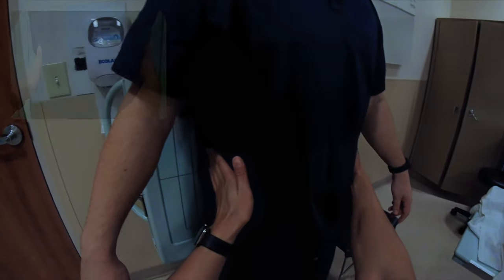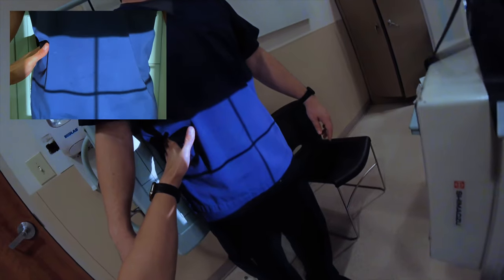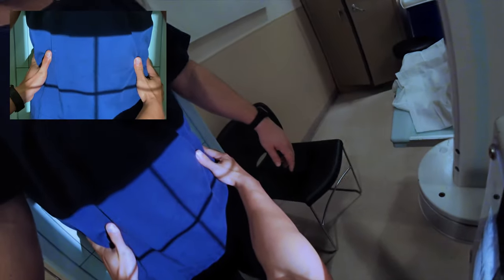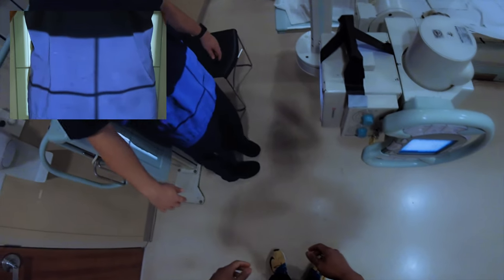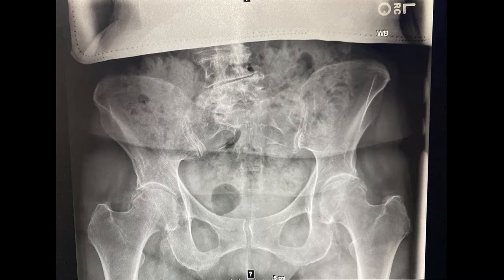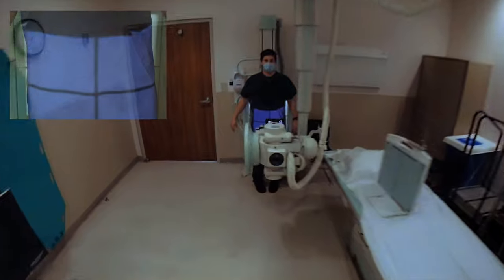Just going to feel the top of your hip here. Take your breath in, blow it out. Breathe normal. I'm going to roll your toes together, kind of pigeon toed there. There you go. All right, hold still. All right.